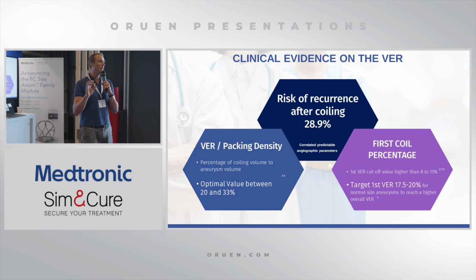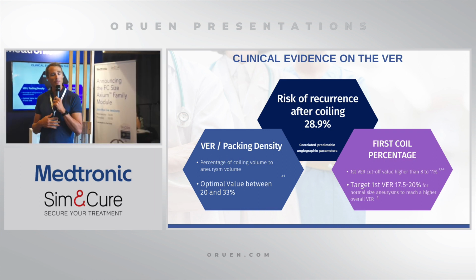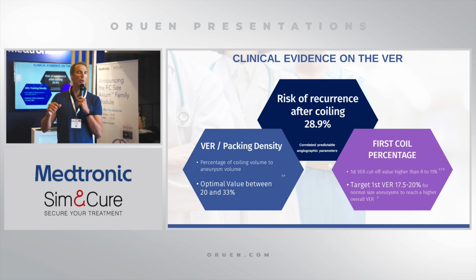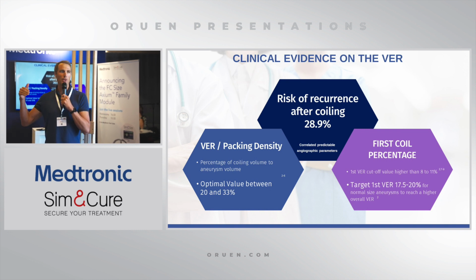you can reduce the need for retreatment of the aneurysms if you achieve a certain level of filling of the aneurysm, what we call the volume embolization ratio. This value has been studied very densely in the literature. Sluzinski and Michel Piotin, who is there, have produced extremely interesting articles showing that when you can achieve a filling of more than 24% in a normal sized aneurysm, I don't speak about giant aneurysms, less than 6 or 7 millimeters, the risk of recanalization is extremely low, almost no recurrence.